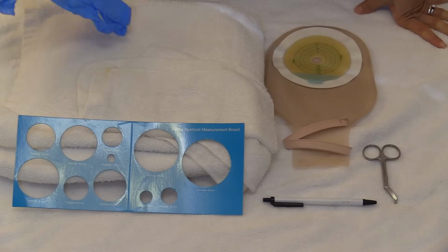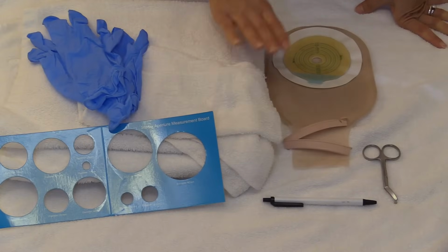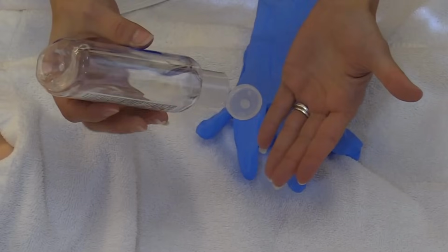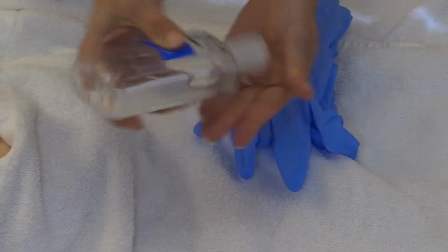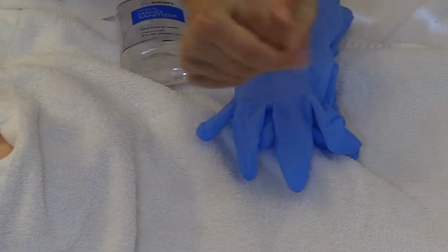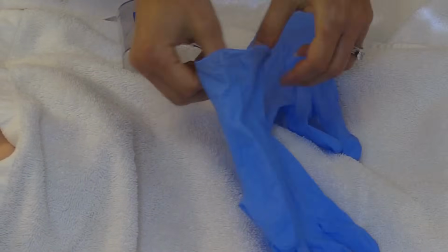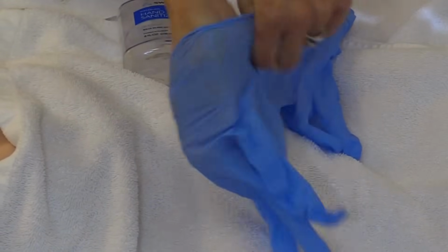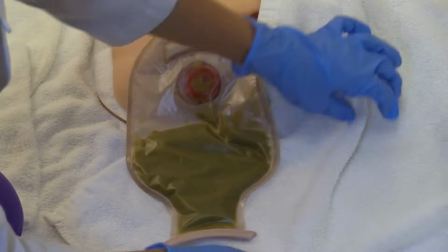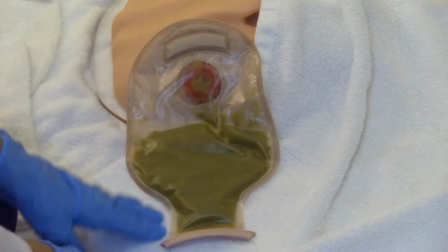And of course you will need gloves. You will need some washcloths to clean the stoma and to dry it, and a towel just to prevent any leakage of stool onto the patient. First, perform hand hygiene, and then you will don gloves. Then get a towel and place that on your patient to protect their gown and their skin from any stool while you're changing the system.